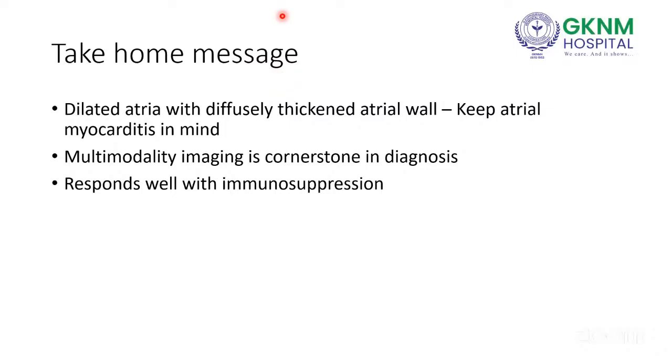Well, a great case. Can you hear me? Yes, sir, please go ahead. Can you slightly elaborate on diffusely thickened atrial wall? Number one, how much thickened, how can you say? Then could LA strain be of some help in these cases, in earlier stages?